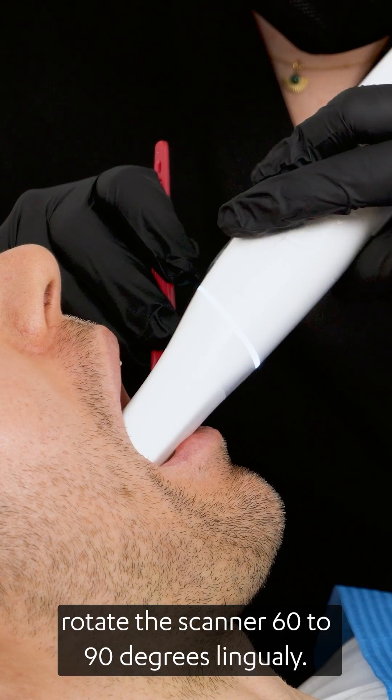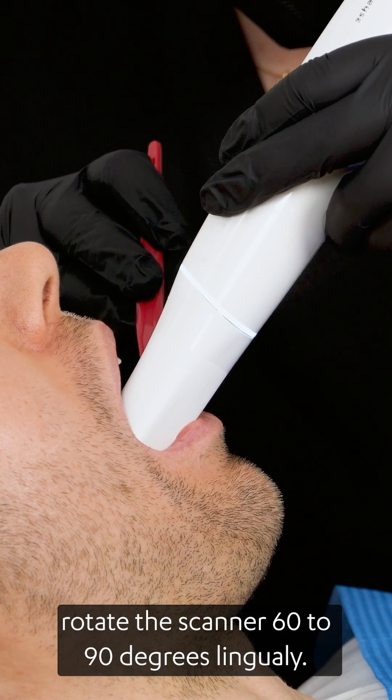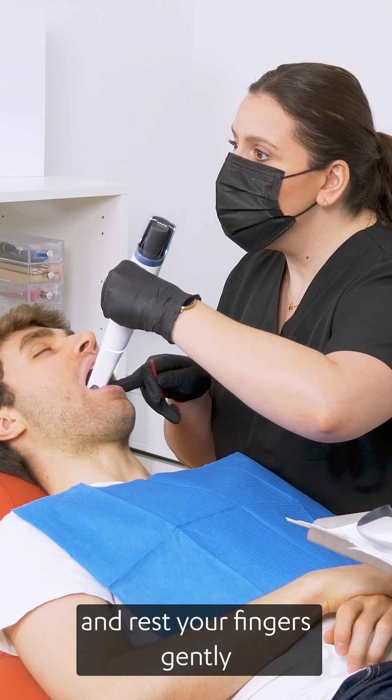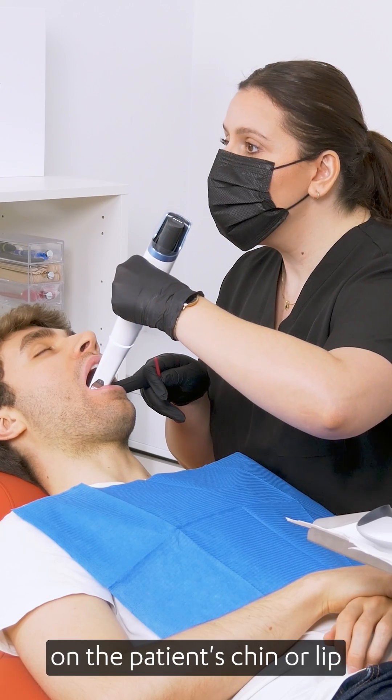At the last molar, rotate the scanner 60 to 90 degrees lingually. Maintain a stable grip and rest your fingers gently on the patient's chin or lip for added control.